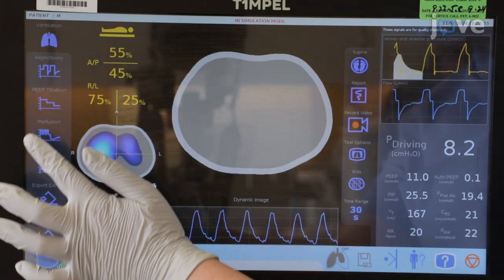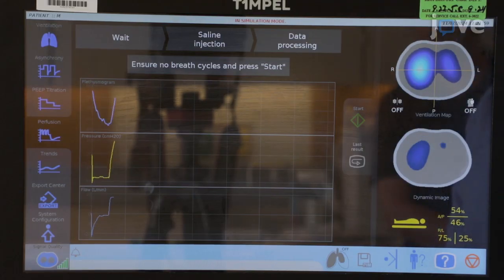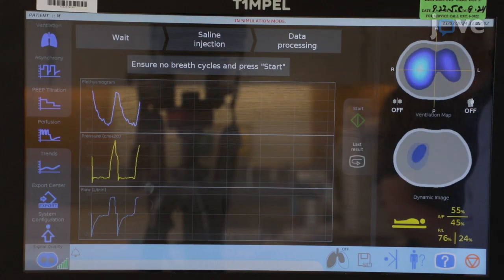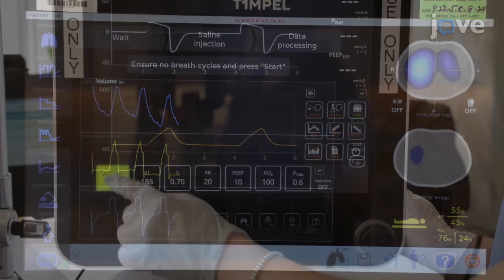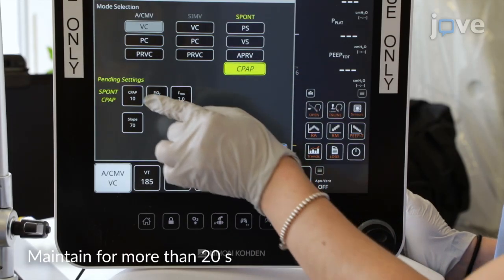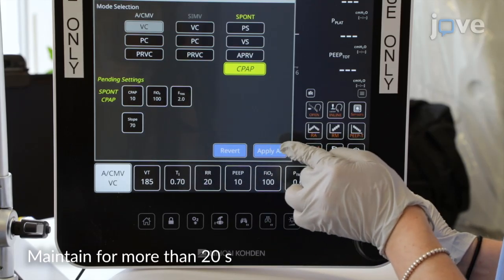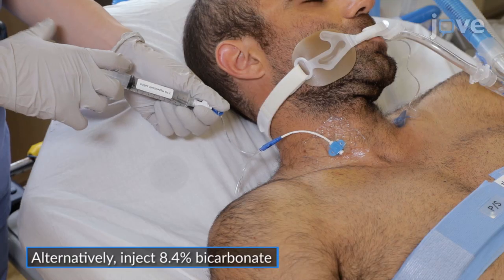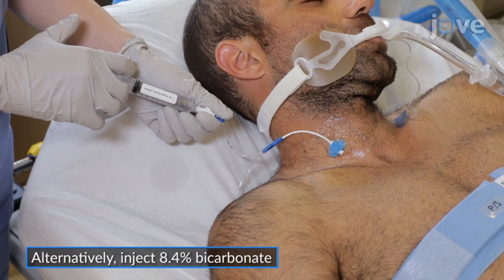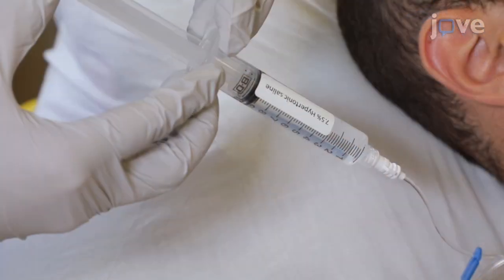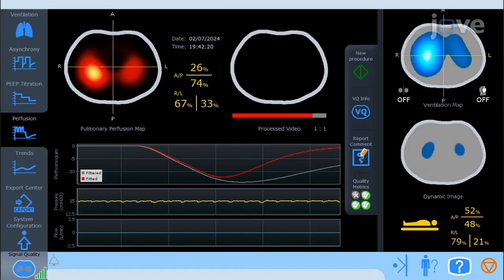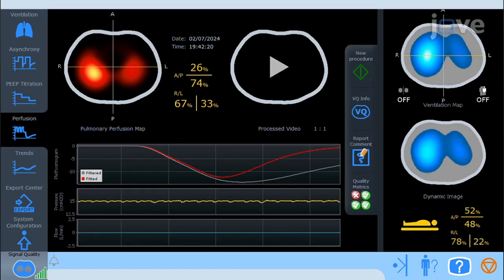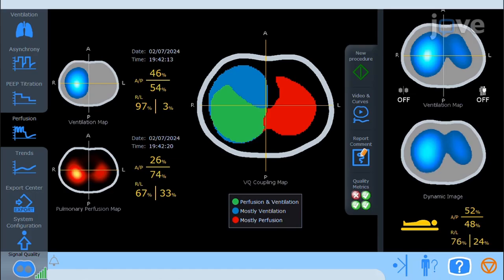First, ensure sufficient patient sedation and, if necessary, neuromuscular blockade, as any respiratory effort can disrupt the procedure. To start the procedure, click on the start icon within the EIT software. Switch to continuous positive airway pressure or pressure support ventilation mode with a pressure support of 0 cm of water. Quickly and consistently, inject 10 ml of a 7.5% hypertonic saline solution through a central venous access catheter at the internal jugular or subclavian vein. Once the injection is complete, return to regular ventilation settings. Finally, obtain the reconstructed perfusion image based on the first-pass kinetics of the contrast flowing through the heart and lungs.